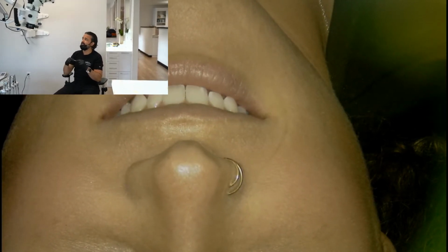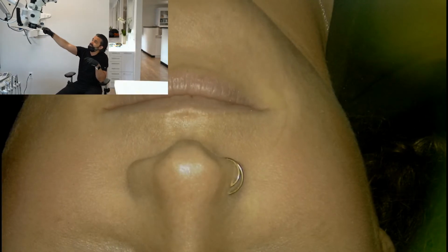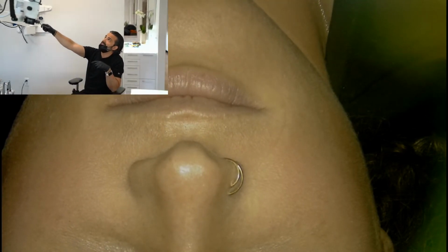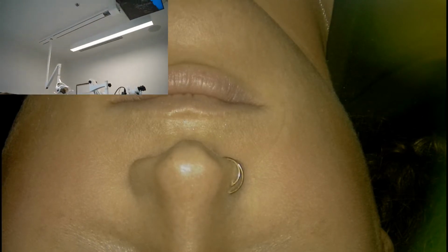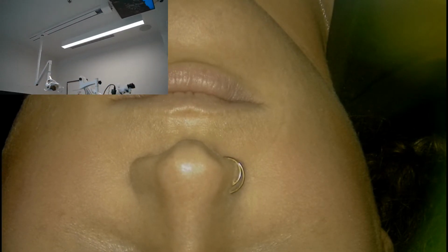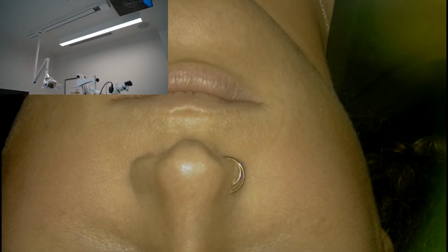Ceiling is a great place to come down, like where this overhead light is. I've done a track system on it, and that's been fine. There's little drifting when that happens, but then you really have to be able to reinforce your ceiling well beyond what sort of code is. And it has nothing to do about a microscope falling off the ceiling. It has everything to do about vibration.